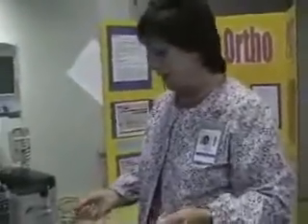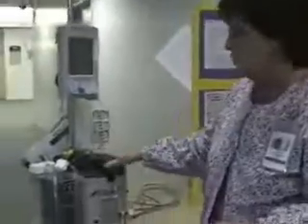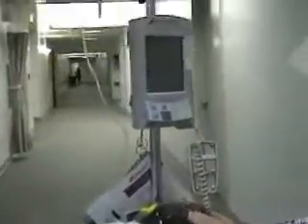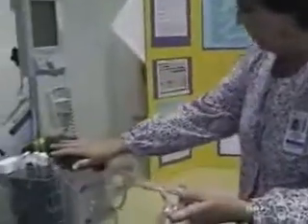All right, I'm Joanna Anderson. I'm a nurse on the orthopedic unit at Saddleback, and I'm going to go over with you the OrthoPat, which is for our total knee and total joint patients, knees and hips. Some of our physicians use this reinfuser to give back autologous blood to the patient after surgery. So our patients come up from the OR, total hips and total knees, and they come with this OrthoPat system with them.